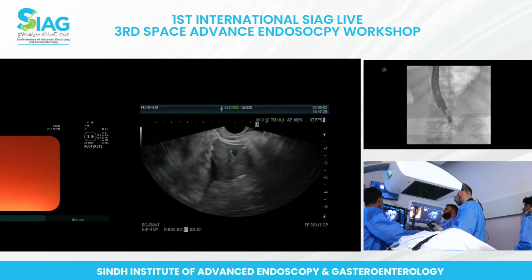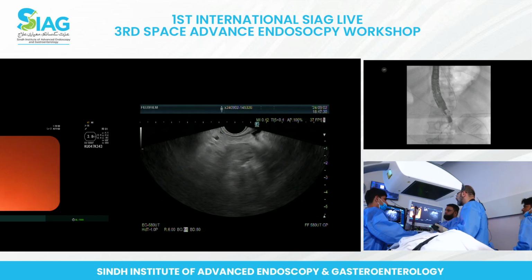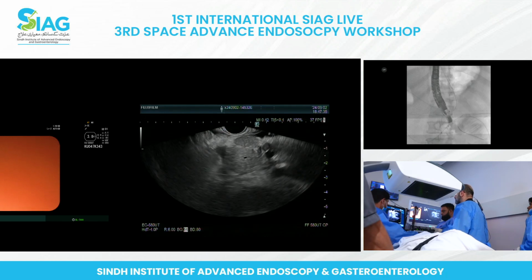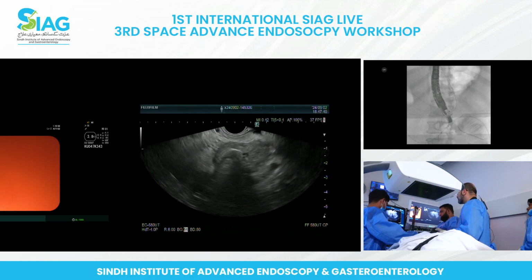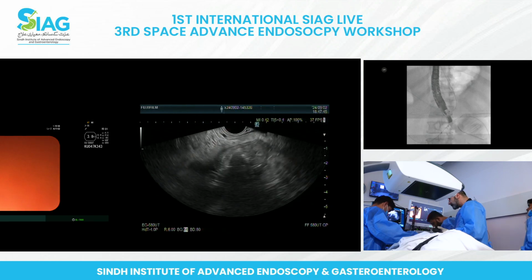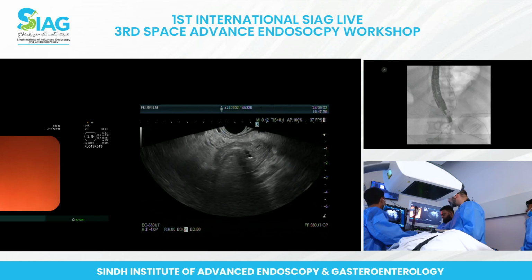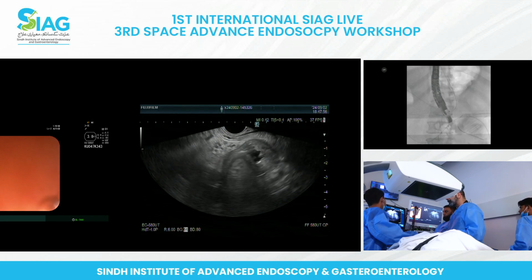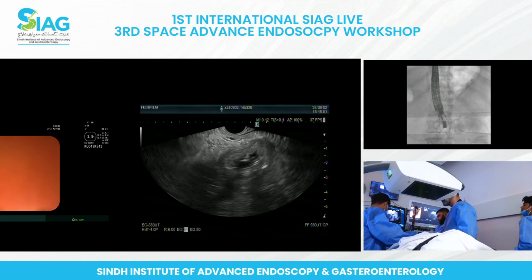Are you going through the pancreas? No, that's mesentery. So, yeah, pancreas, I have to pull back. This is pancreas. So it's not uncommon to see mesentery. If you can find a window where you can get off the mesentery, that's good. Ironically, the balloon is right where that may be. So I may, but no, I think even there, but this is okay. I may just pull the balloon back a tiny bit just to see if that area distends.